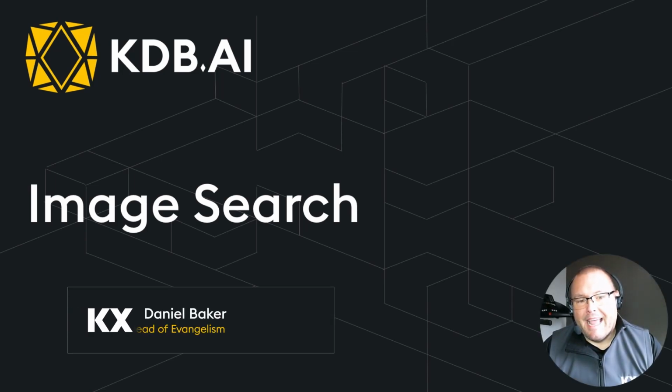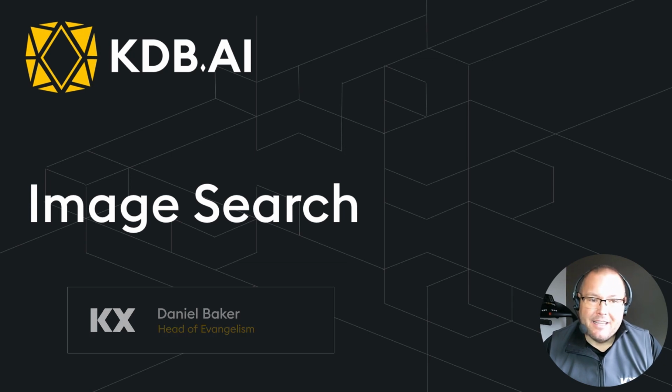Hi everyone, I'm Dan, and in this video I'll be showing you how to perform image search using KDB.ai.